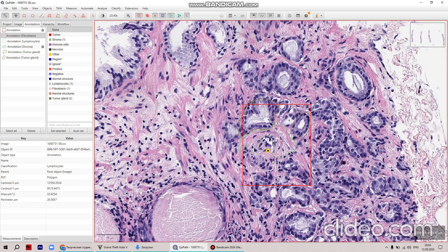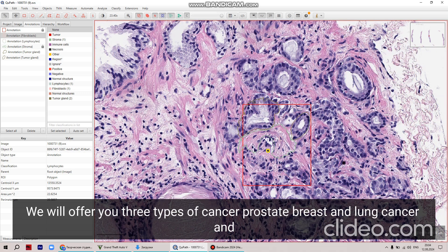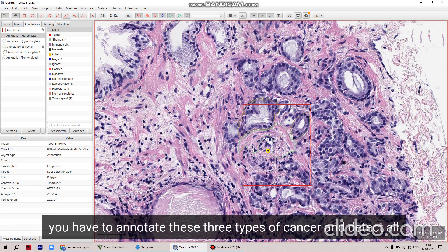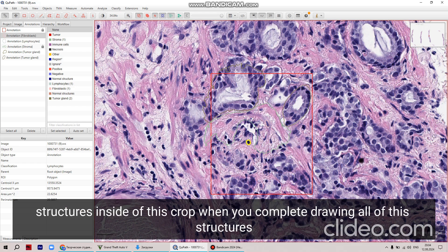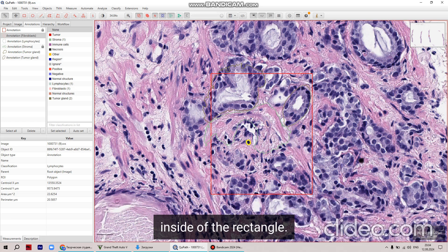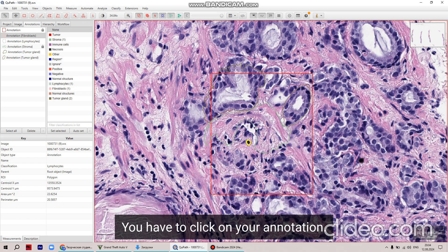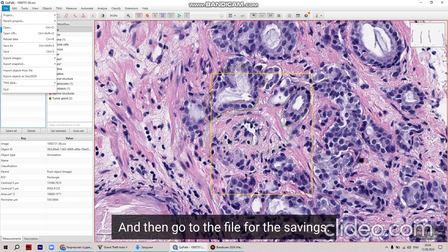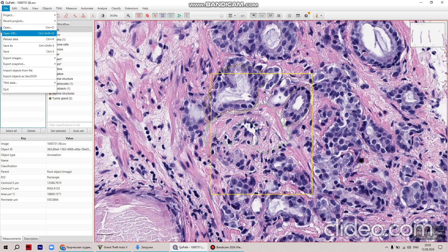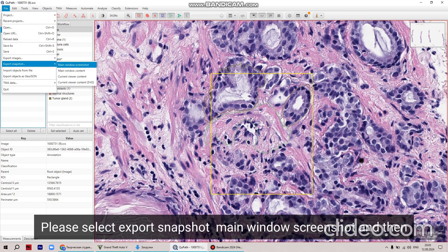When you choose an area — for example, these structures — you go to the annotation tools and click on the rectangle. You create a rectangle on the image, click on annotations, and pay attention to the perimeter. Choose an overall size of approximately 500 micrometers. You can see the perimeter at 550 micrometers.